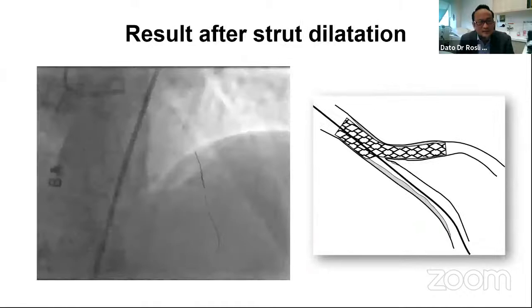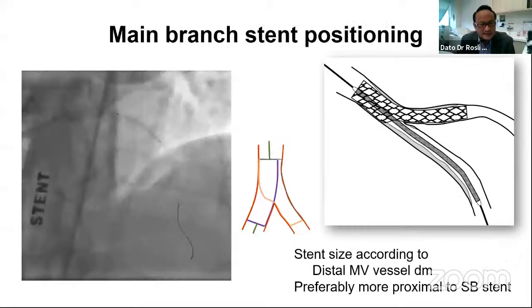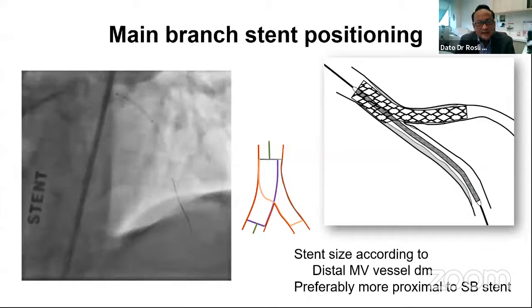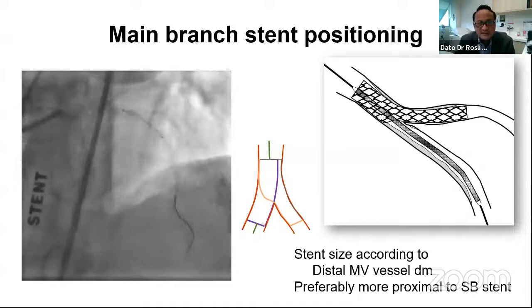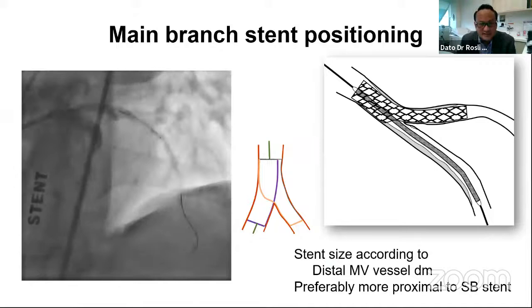So you can see that the LAD, at least in this case, is quite well prepared from the initial balloon dilatation. Then you put in the stent, and the stent should be sized according to the main vessel in the distal. Preferably you end the stent slightly more proximal than the stent that you placed in the side branch. This is to ensure that you can get a well expanded stent, especially if you are using a slightly bigger stent than the side branch stent. So once you have done that, you deploy the stent.